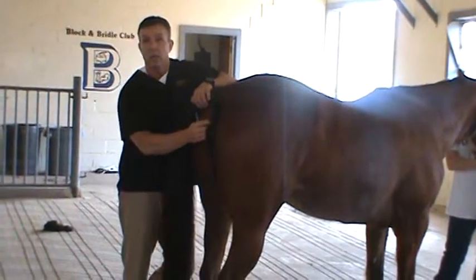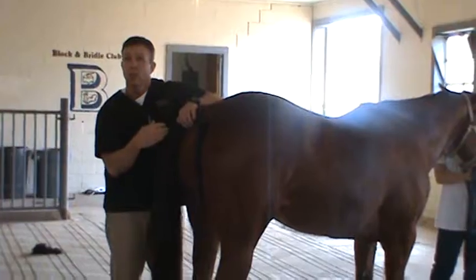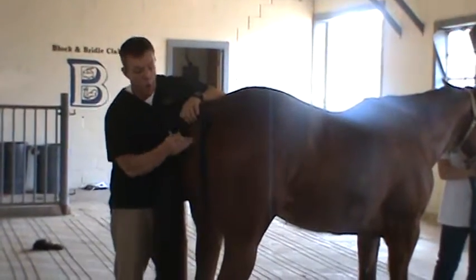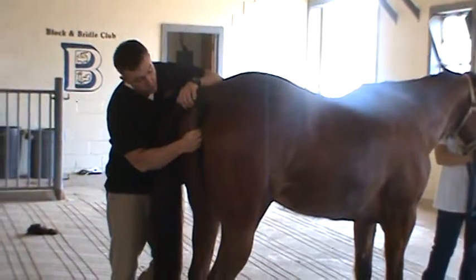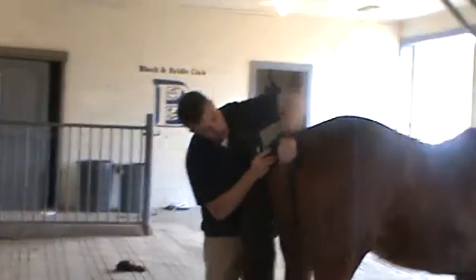And we're going to actually close that. Once it heals, it forms a wall. And we're going to do that two-thirds of the way from the top. So her vulva opens here all the way to this point. If I put a Caslick in this mare, I'm actually going to close it two-thirds of that length.